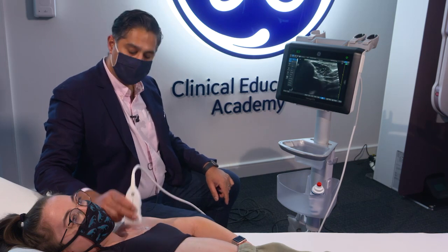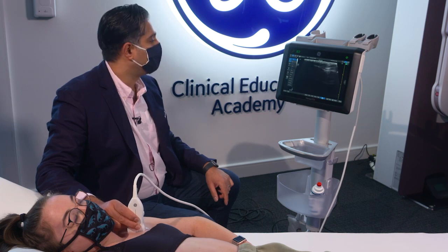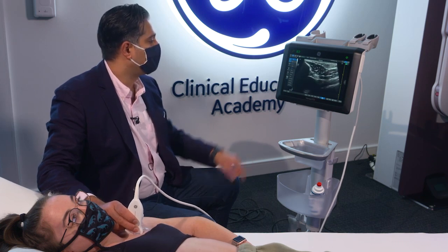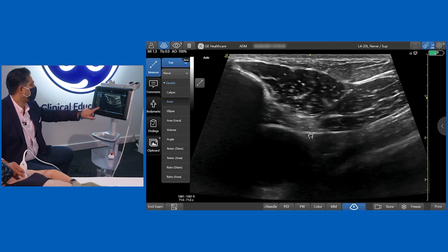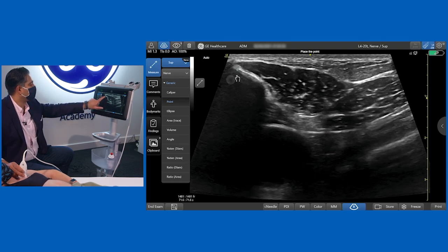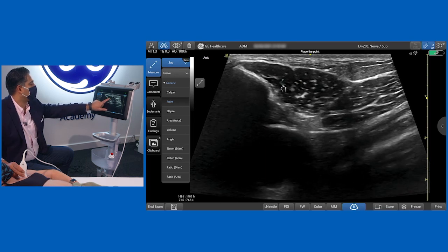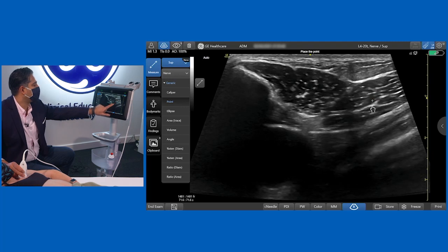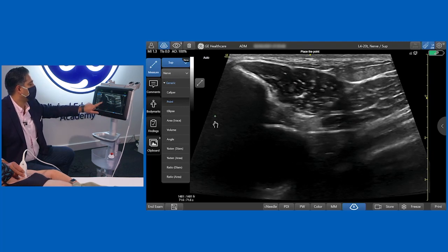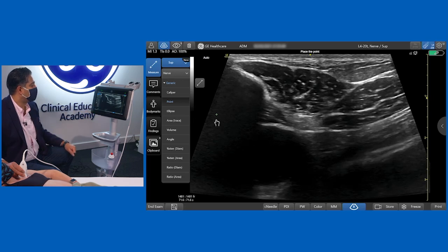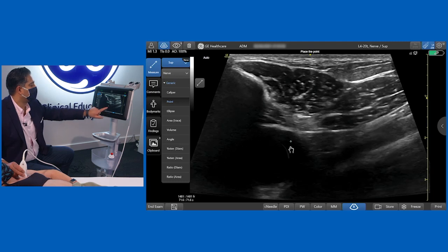We're going to start off by scanning for the infraclavicular brachial plexus block. I'm using a high-frequency linear probe, which I'm initially going to place in a paramedian orientation. The left-hand side is cephalad, and the probe is resting on the clavicle. This is coming into pec major, and deep down here you're going to find lung. I've placed the probe relatively medially and I'm going to slide from medial to lateral.